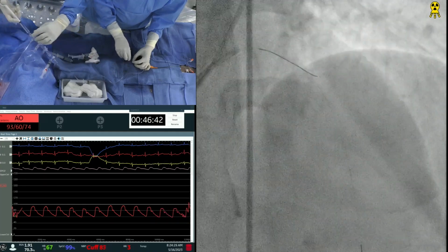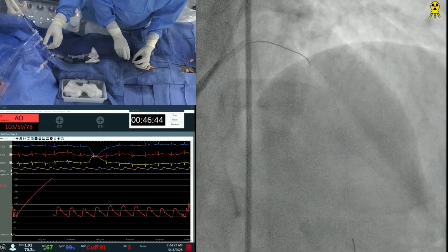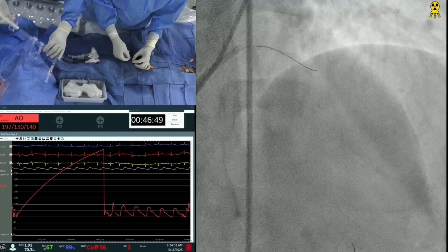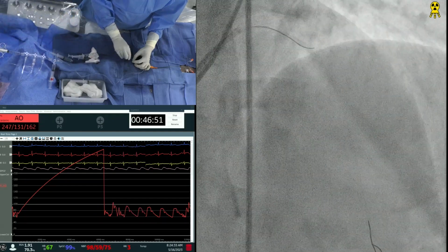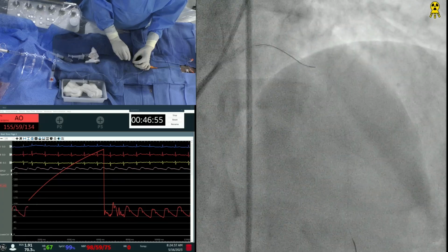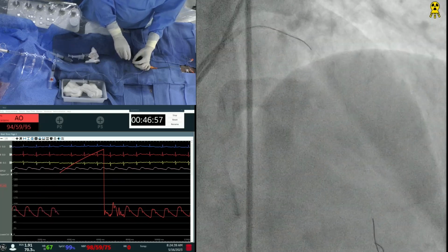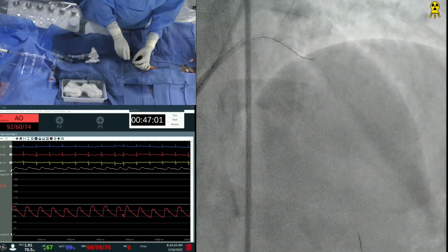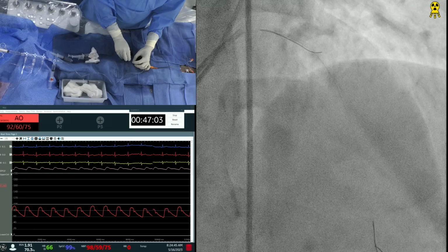This is a pouch. Right, exactly in the middle. I can understand the slow flow and all that, but why a lesser rate of perforation with the slow speed? No, I think it basically is creating less friction, less heat generation. Yeah, those factors.